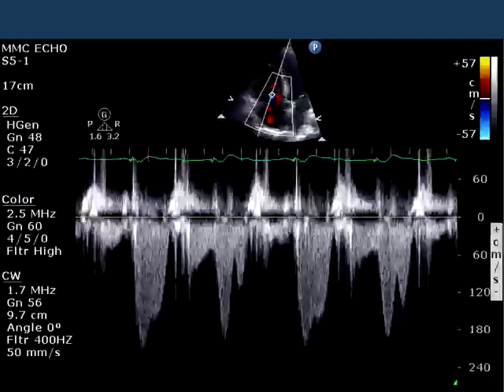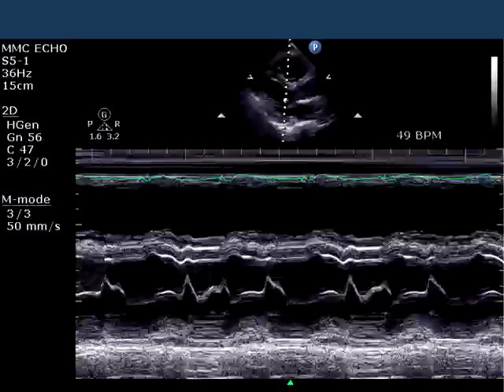What's the reason that the tricuspid regurgitation signal looks the way it does? Here's an M-mode of the patient in the parasternal long axis through the mitral valve. You'll notice that there appear to be E waves and A waves, but they aren't necessarily coming in standard intervals or standard places.